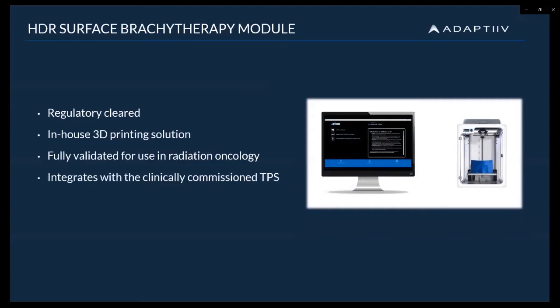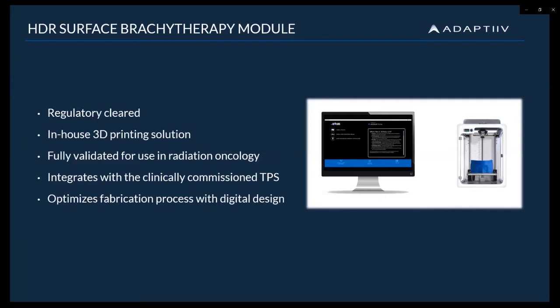Through integration with a clinically commissioned TPS, you can optimize the fabrication process through digital design, reducing the time and skilled labor required to produce an applicator for clinical use.